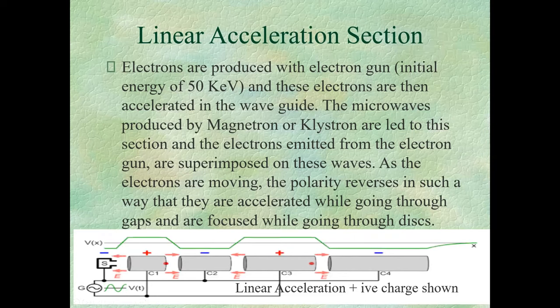When the beam strikes one side, it goes through the other side. And these chambers monitor the dose rate of the machine, the integrated dose that's passing through, and field symmetry. So field symmetry is one of the important things. Whenever you tell a service engineer that the symmetry and flatness of your machine is out, they try to adjust the field symmetry, and flatness gets adjusted by adjusting the symmetry of the machine. And symmetry is something that these ion chambers are monitoring.